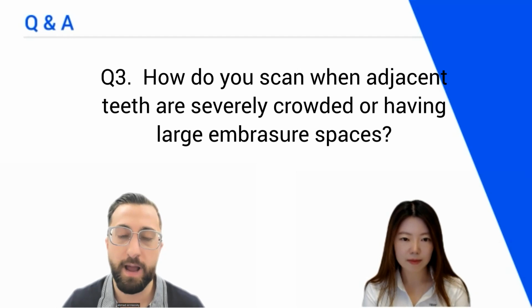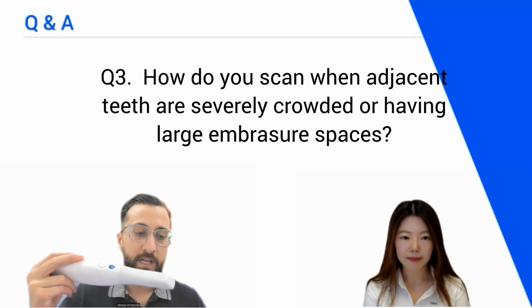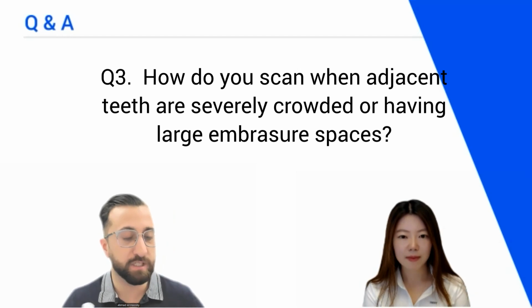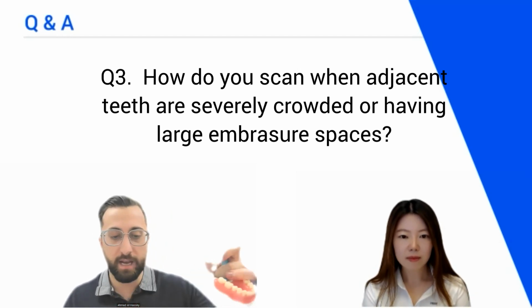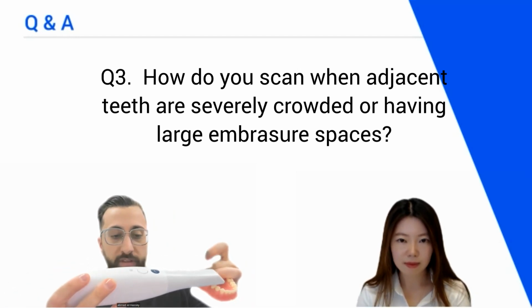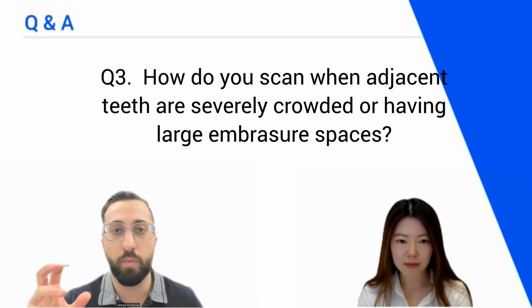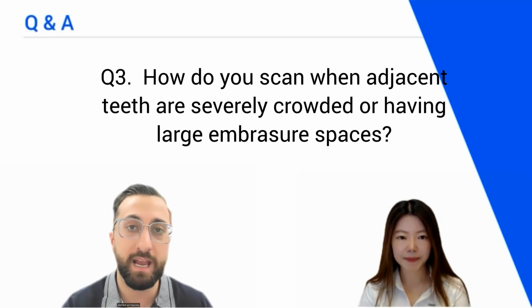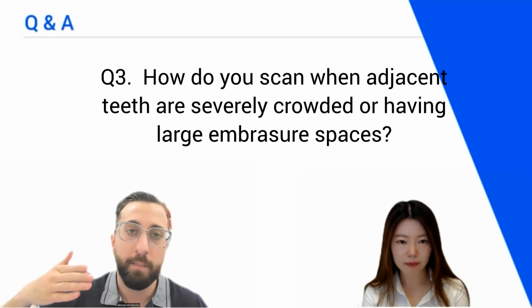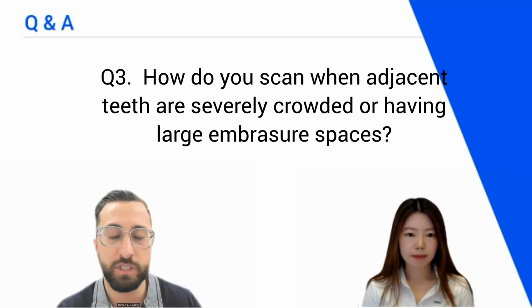And my best advice is what I mentioned when we were talking about scanning and getting comfortable. I have my scanner here, just getting comfortable with rotation in the wrist when you're scanning. And if I have this model here, I can show what I mean. If this is the rotated tooth, I would come from 90 degrees and rotate this direction. It takes some practice, but it really is just tackling that contact from all the different directions, not just from the occlusal and lifting the scanner up, but almost from the buccal and rotating the scanner mesially and distally to try to capture that region.